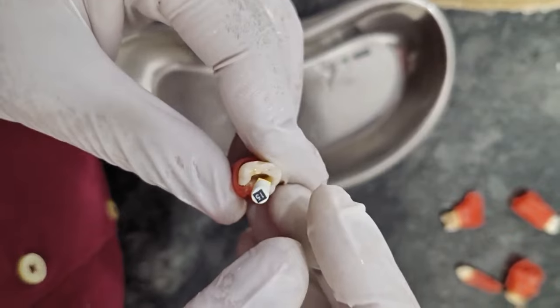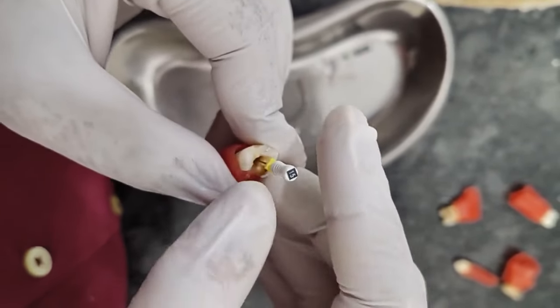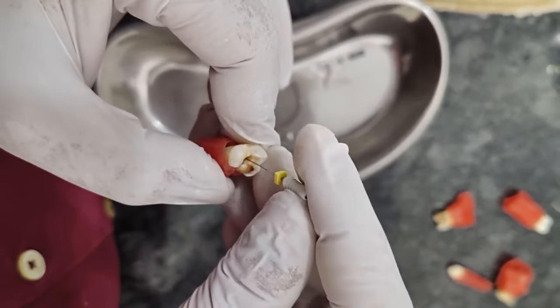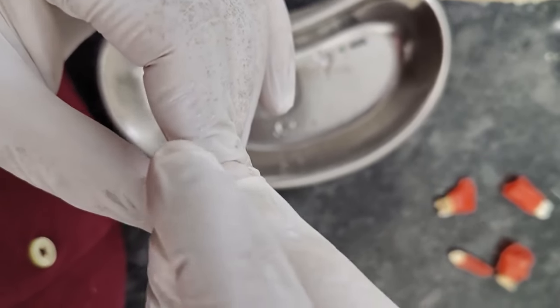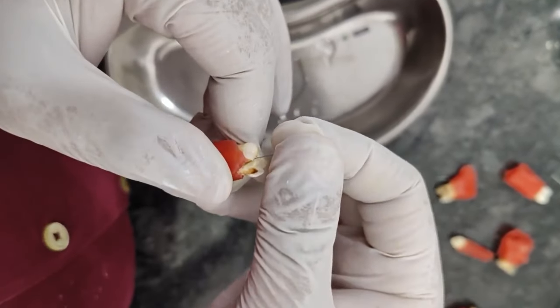Now we have inserted the number 15 K file inside the canal, and again we have to enlarge the canal till the working length. So this is the distobuccal canal. Prepare it to the working length.